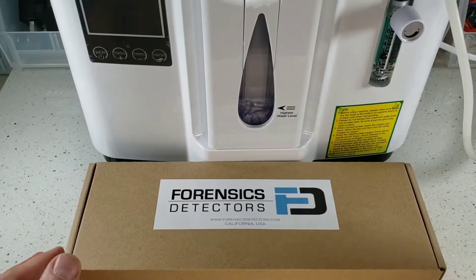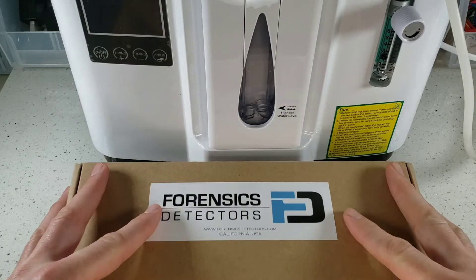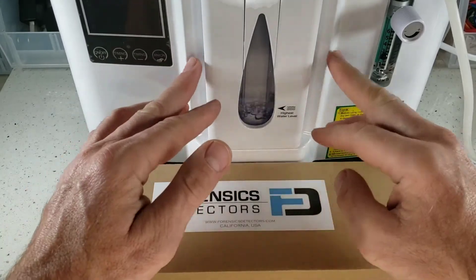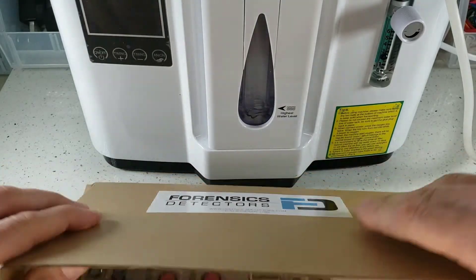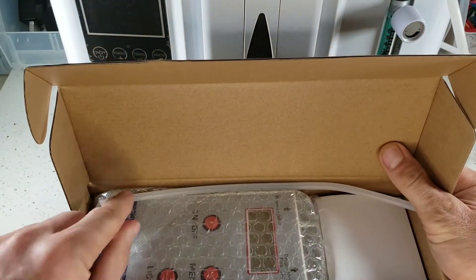Thanks for joining us today. We're going to be unboxing our oxygen analyzer. It comes in a wonderful box, perfect to check your oxygen machine concentrator levels. Let's go ahead and simply open up the box here.